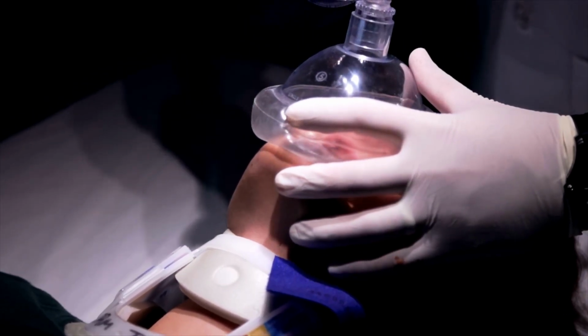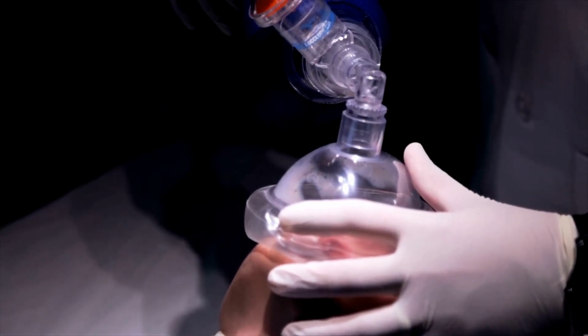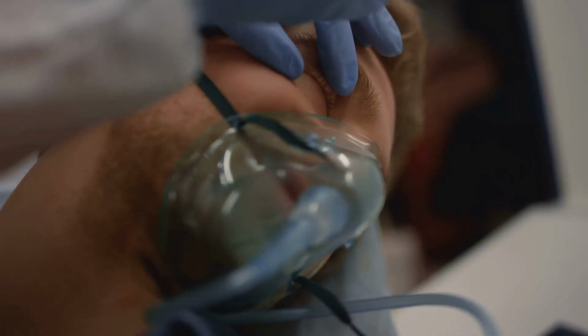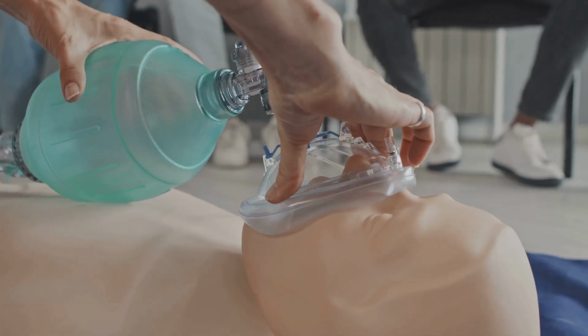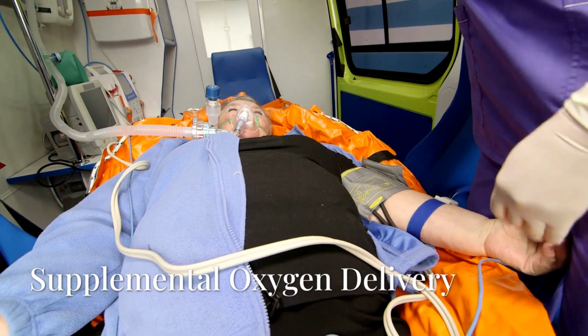If the airway is still not adequate, escalate to bag valve mask ventilation with high-flow oxygen. Always maintain a proper seal and ensure chest rise with each ventilation. Two-person BVM technique is preferred if resources allow.